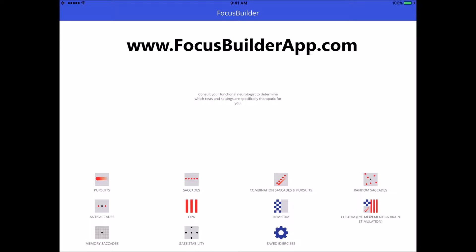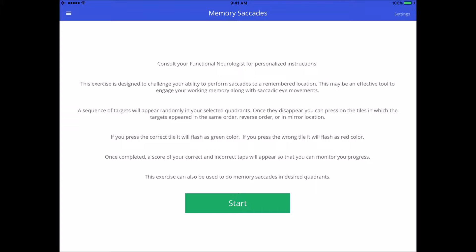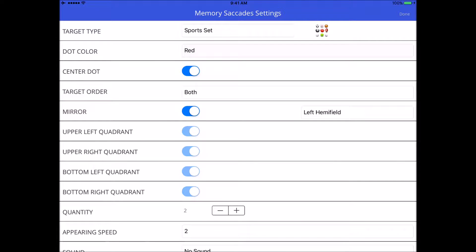Memory saccades are a great tool recently added to Focus Builder. It's really great for challenging patients' ability to work their working memory and exercise the working memory. Let me run through exactly what the settings are, what they mean, and how to use this exercise.